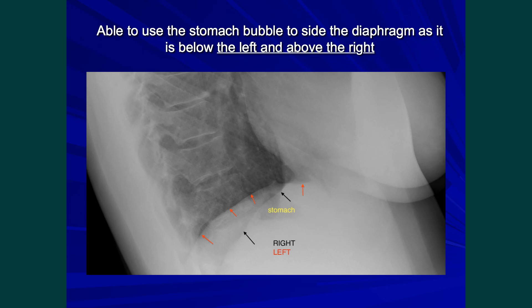Another important aspect is that if you can see the stomach bubble, and the stomach lies below one diaphragm and above another, it must lie below the left hemidiaphragm. In fact the left hemidiaphragm can be seen just here.